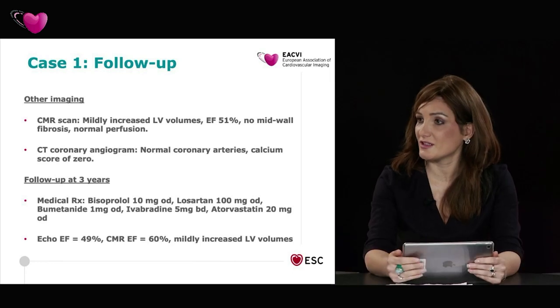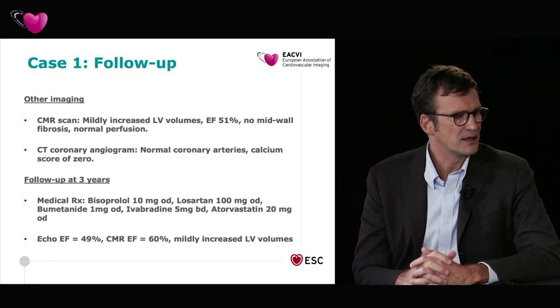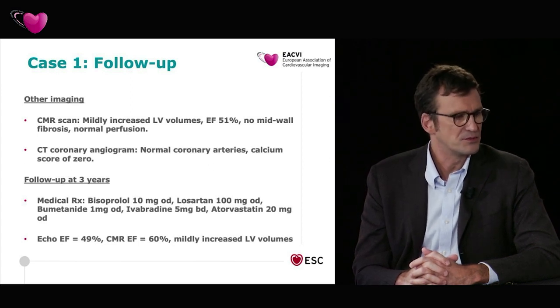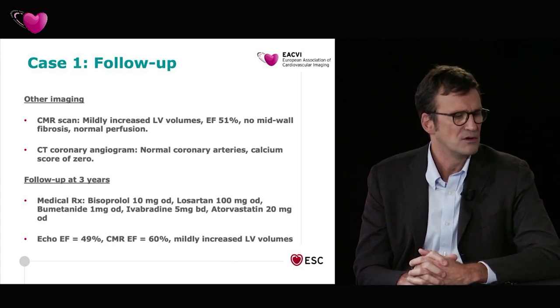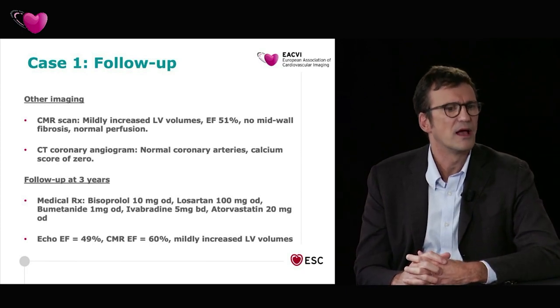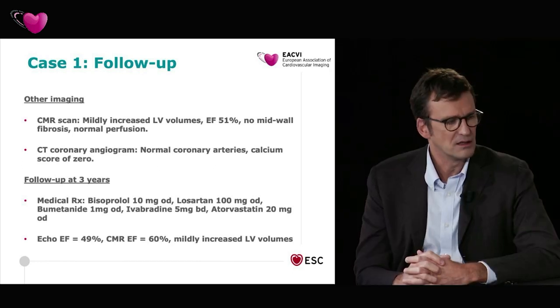Of course. What is your experience? Absolutely right. It's very interesting in other settings when you can assess perfusion, for example, in viability tests. Absolutely, yes. That is a major prognostic factor, that there's viability at least at the perfusion level, but not appropriate to this case. But when you have the assessment of perfusion, even at rest in cases of viability, obviously with different cutoffs, Raj has published a lot on this in the early days of perfusion.